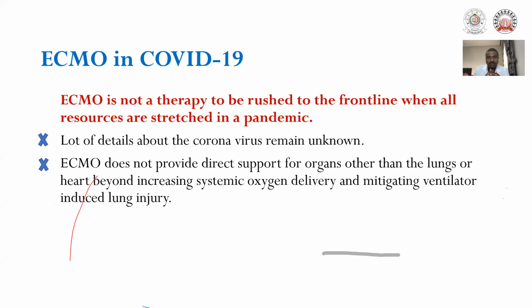What is the natural history, whether the virus will persist, and what are the precautions that you have to take for the personnel who are taking care of ECMO machines in the isolation rooms. What is the adherence of this virus to the tubing that you are using, how the patients might benefit from the treatment, and a lot of information we need to come up with. This needs extensive research.